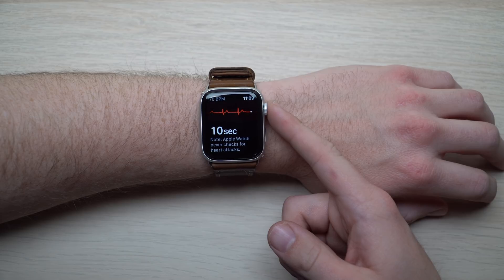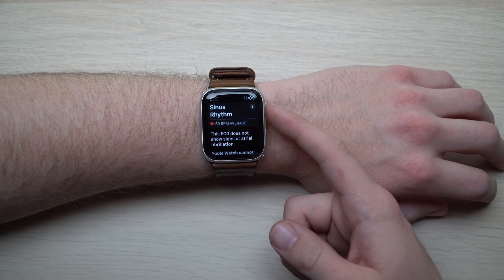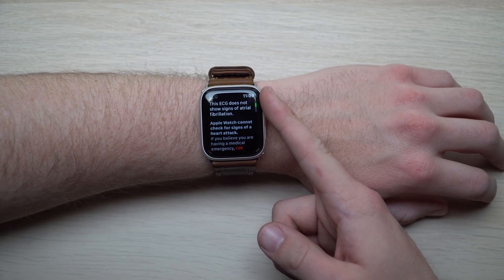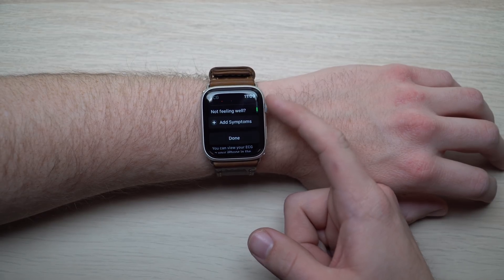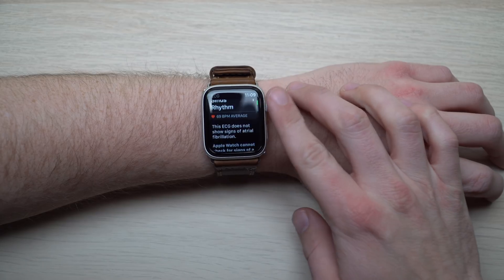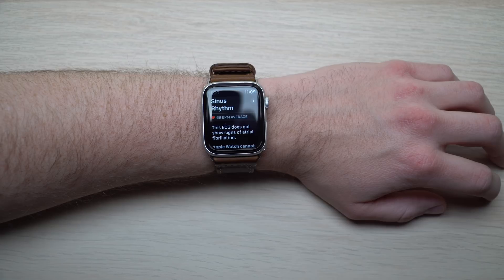You can see the measurement for the ECG as it's taking your reading, and you can also see the beats per minute of your heart rate in the top left corner. Apple also puts a disclaimer that the Apple Watch does not check for heart attacks, just for irregular heartbeats. You'll also want to make sure the Apple Watch is pretty tight on your wrist as you take this measurement. When you're done with the test, you can see your results. For me, it was an average sinus rhythm, and what that means is that the heart is beating in sync — the upper and lower chambers of your heart are beating in sync. There's no irregular heartbeat rhythm.